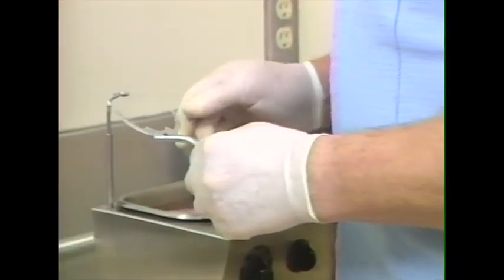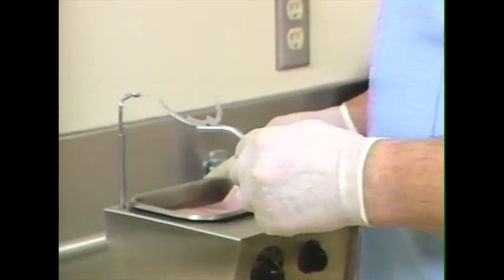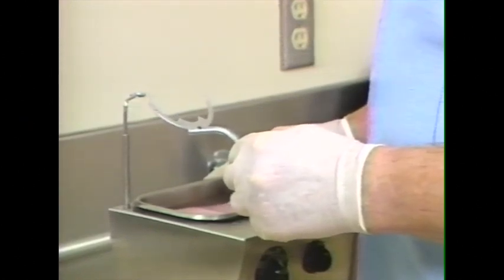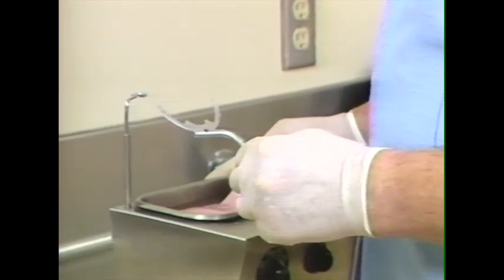Today, Mrs. Johnson, we're going to use this caliper device, which fits into your ears, to transfer the relationship of your upper jaw to a laboratory instrument. To prepare the bite fork for the face bow transfer, we're going to use a sheet of baseplate wax as the recording medium. Compound can also be used for this purpose, but baseplate wax is a little more simple to use.